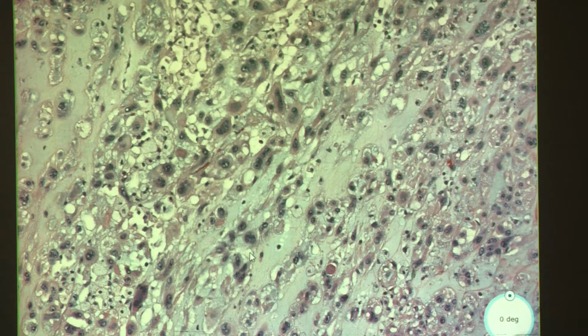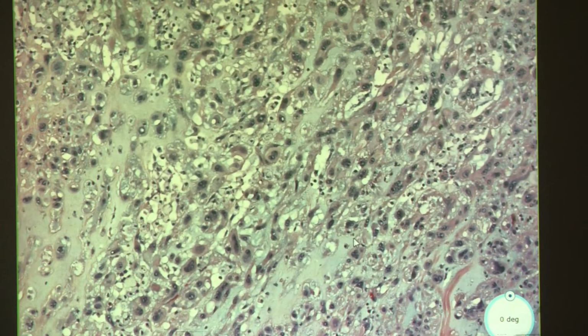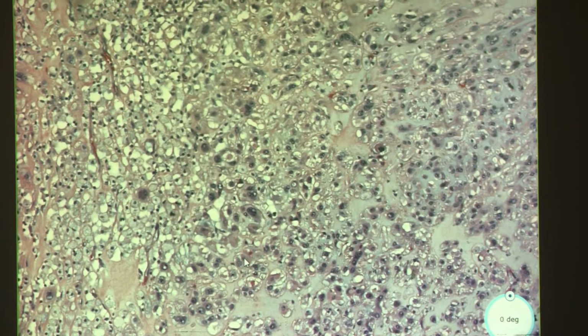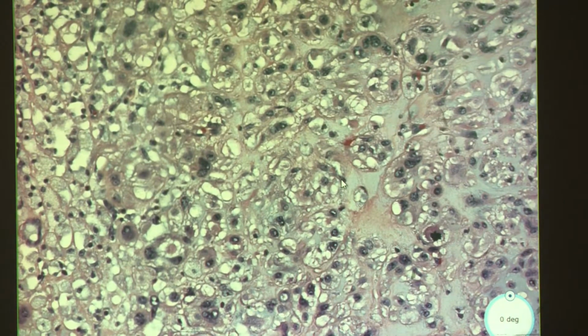Some of them are a little more smooth, some of them have prominent nucleoli, and some of them are just extremely hyperchromatic, like this guy down here. Didn't want to zoom in that much. And what we also see is that even though we have this definite myxoid type background, some of these cells kind of give us a semblance of maybe they're adipocytes or trying to be adipocytes. What else? I know I saw some of them where we have these pseudo-nuclear inclusions. So hopefully you're able to pick them out. They're kind of everywhere in this case.